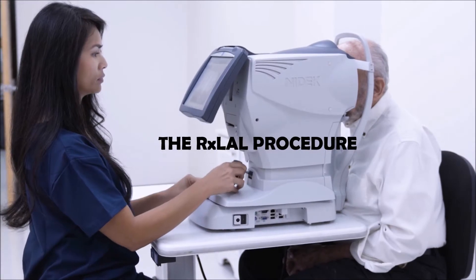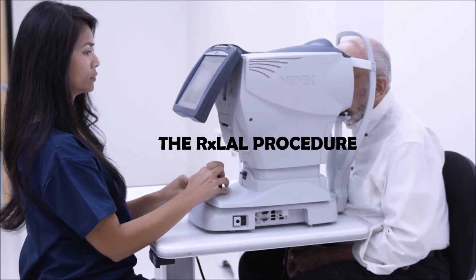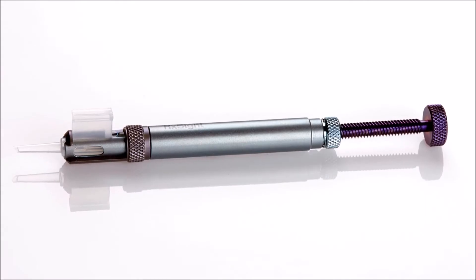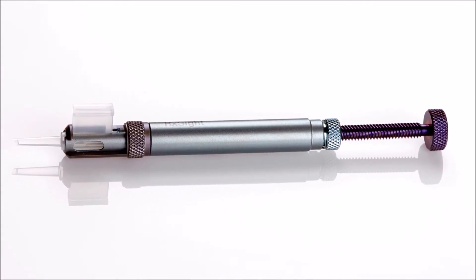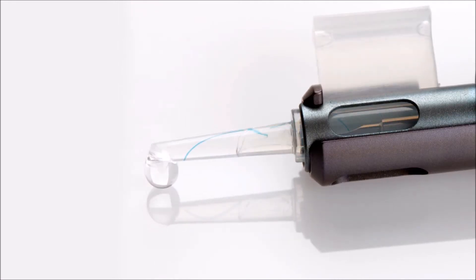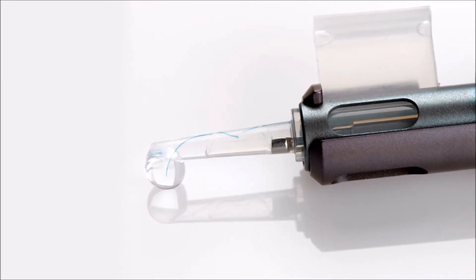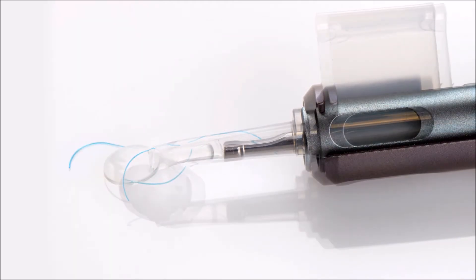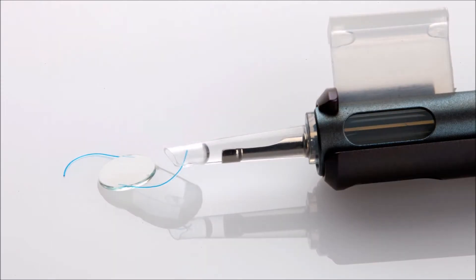Prior to surgery, routine preoperative measurements for monofocal base power selection are performed. The RxLAL is implanted with a proprietary injector through a small, clear corneal incision into the capsular bag using standard surgical techniques for a 3-piece silicone IOL. There is no additional time added to the cataract removal or IOL implantation procedure.